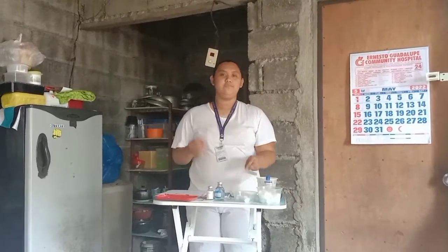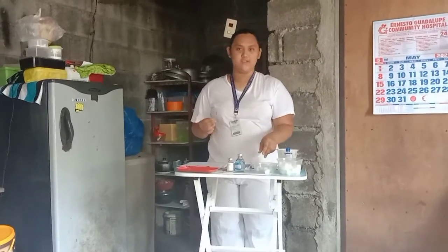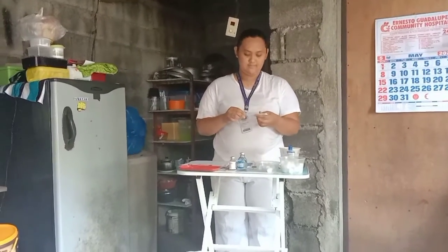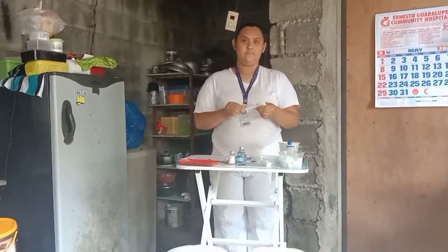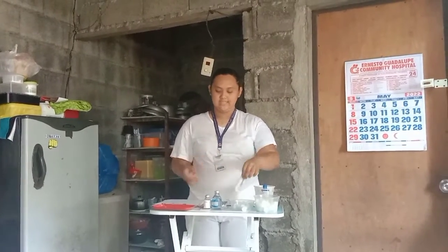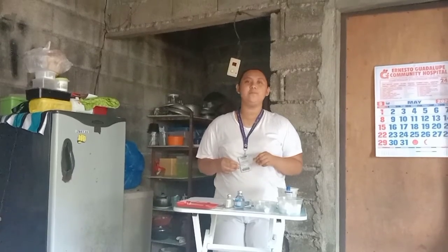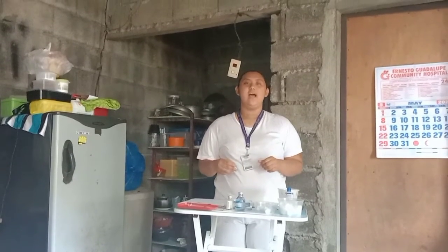Then remove the cap and connect the tuberculin syringe to the aspirating needle. We also have to open the package of the vial device that connects to the barrel. In the aspirating needle, we need to secure it. Then set aside. Then open the medication vial and clean the rubber seal using soft cotton balls and 70% alcohol.